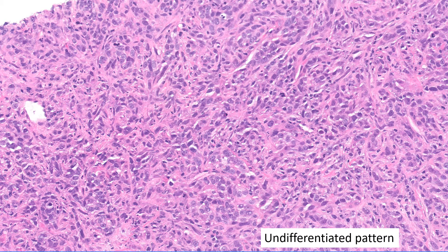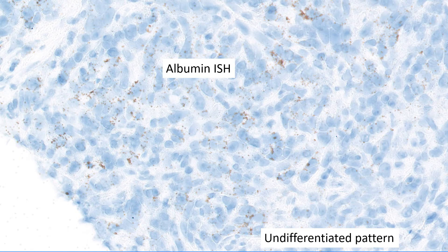Perhaps the most diagnostically challenging pattern is the undifferentiated pattern. The challenge is: how do you prove this is a hepatocellular carcinoma? We eventually called this HCC because the patient had a prior hepatocellular carcinoma, and this was metastatic somewhere in the abdomen. While it looked nothing like an HCC, we did have one stain that worked — albumin in situ hybridization was positive. Remember, albumin is fairly specific and sensitive for hepatocellular carcinoma. Every other stain, including my favorite, Arginase 1, was negative. Between the prior history and the albumin, I was fairly happy to call this a metastatic HCC. But this pattern can be extremely challenging if you do not have a prior history of HCC.